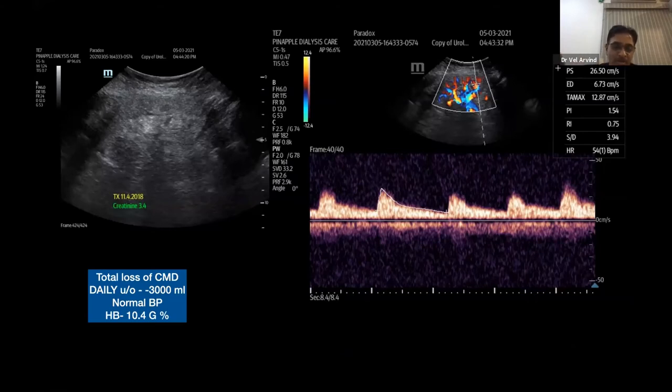In the third, fourth month, he started showing creatinine of 1.2, 1.4, 1.7 like that, and the graft looks almost totally lost. This is my observation, all 3 patients had recurrence of oxalosis. But the spectral flow pattern is normal. Oxalosis typically involves the interstitium and tubules, and the vessels are not involved. That's the point I want to make here, that the rejection process is not that. So this patient makes a good urine output. Next, we have placed him on a cadaver transplant list for both kidney and liver transplant.